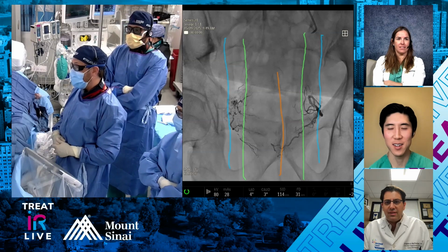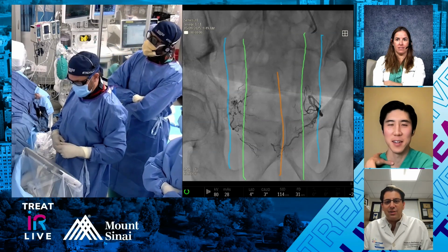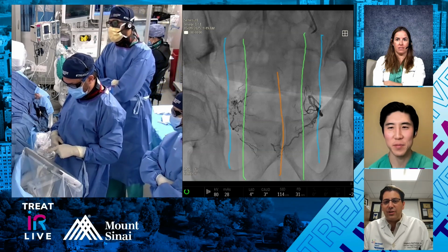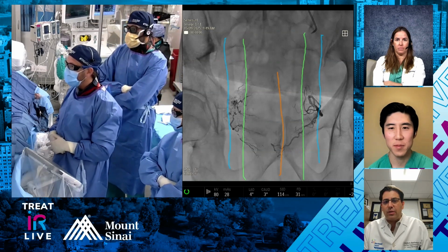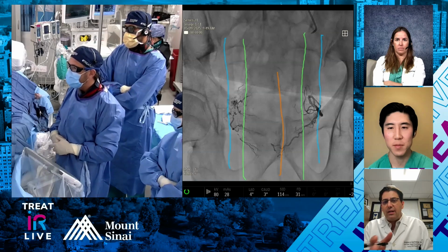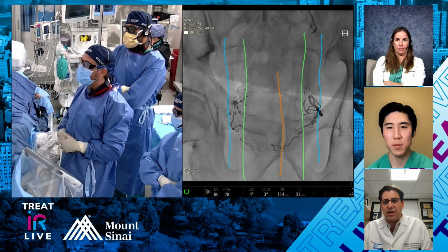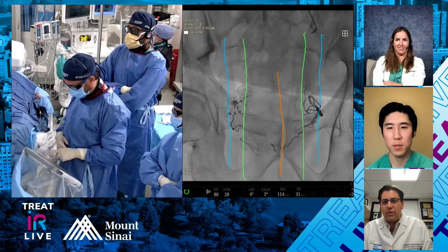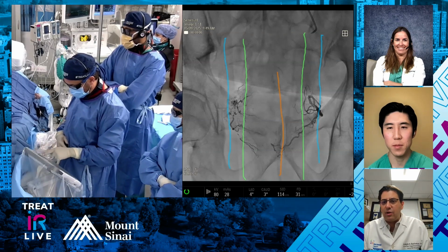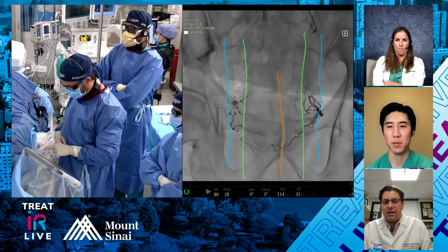do you want any more colored lines on the screen, Art, or can you describe it with these 3 colors that I have here? No, I can do that with the 3 colors. Basically, if you're just up to the blue line, that's really a 1. Between blue and green, then the green between green and the orange is a 2. Once you get to the orange line is essentially a 3. And there's some understanding of what the vascularity looks like in an 89-year-old prostate as well. So he's shown us our 3 grades of this.